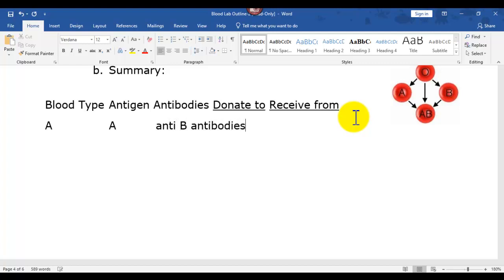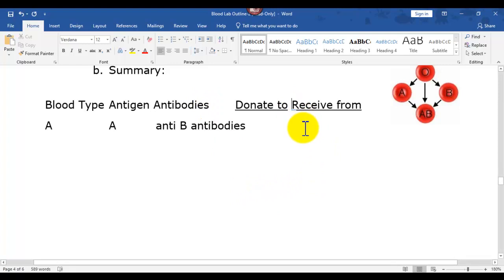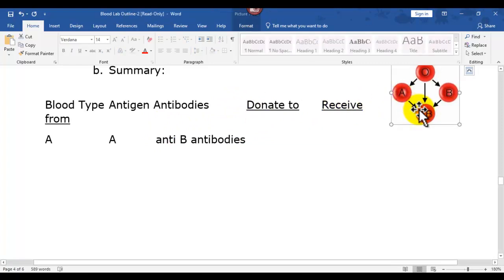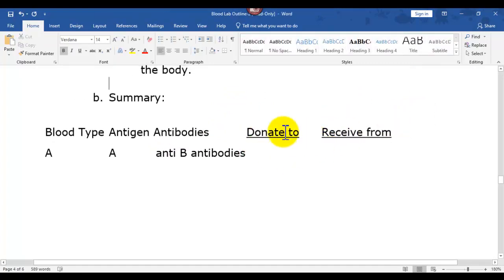antibodies. And I was trying to make this as real life as I could. So far, it's ending up being a cluster. Okay, let's see. All right, I'm just going to take this guy out. Sorry. Diagram, you got to go away. I'll do the best I can.